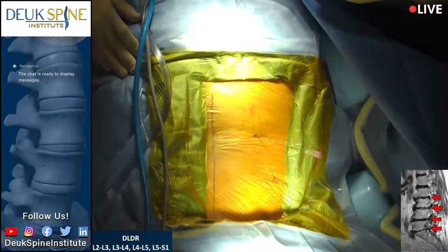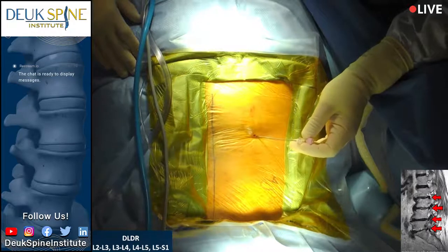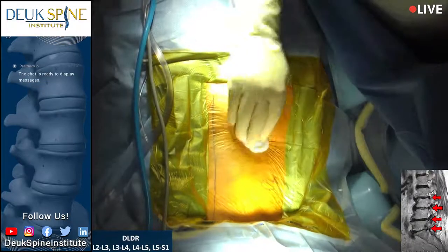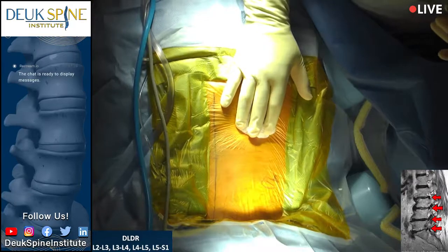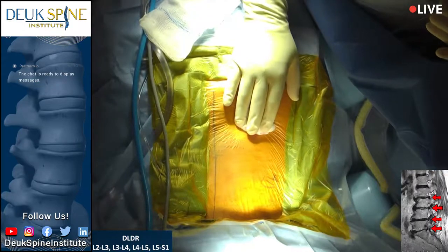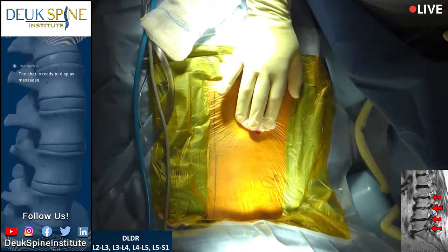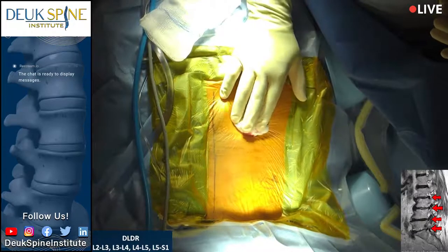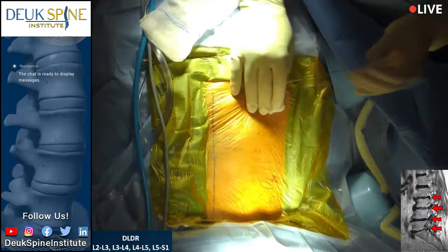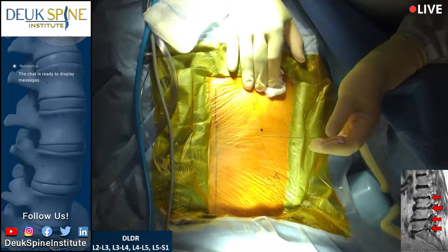So it's not terrible, Jordan, but let me see what I can do, okay? We really want what's called a true lateral, and we want a true lateral at the level we're fixing. To give you an idea of what that means, you want to be able to see through the true side of the spine, because the spine is three-dimensional. If the trajectory of your X-rays through the body is not exactly lateral to the segment of the spine we're working on, in this case L5-S1, then you're going to have what's called a rotatory effect, or rotation. The image you get is not going to be an accurate representation of where you are on the patient.